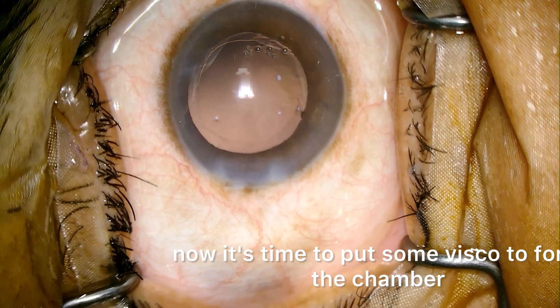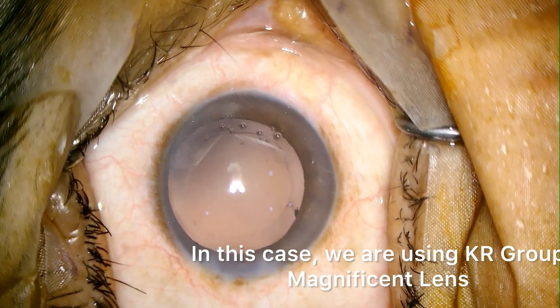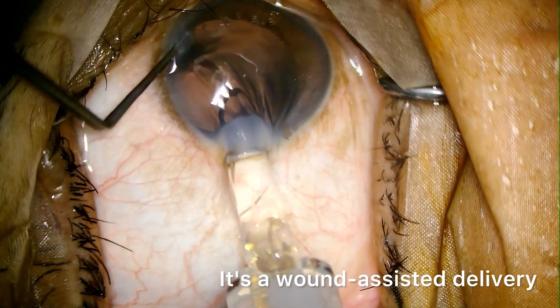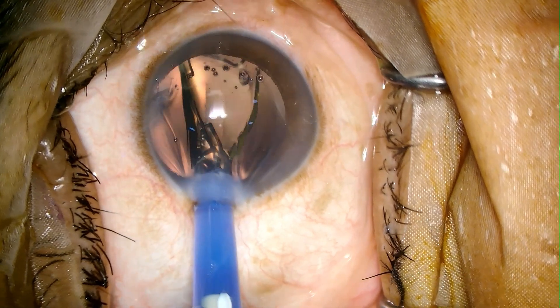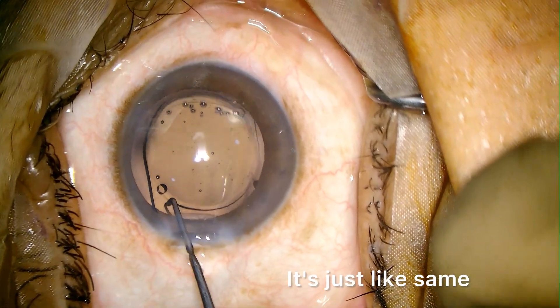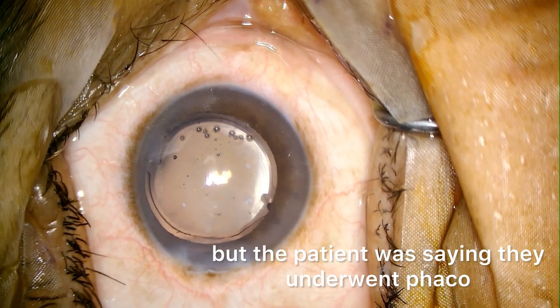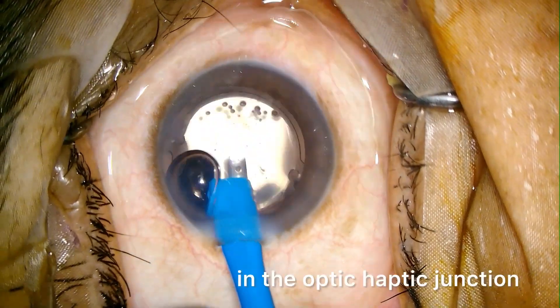Now it's time to put some visco to form the chamber. In this case we are using Care Group Magnificent lens. It's an advanced monofocal lens. It's a wound-assisted delivery — I use a dialer on the side port to push the lens through the injector. As you can see in this lens, there are two holes, just like what we get in PMMA lenses. Initially when I saw cases of other surgeons using the Magnificent lens, I thought it must be a PMMA lens, but the patient was saying they underwent phaco. Later on when I started using it, I came to know that this lens has two holes in the optic-haptic junction.